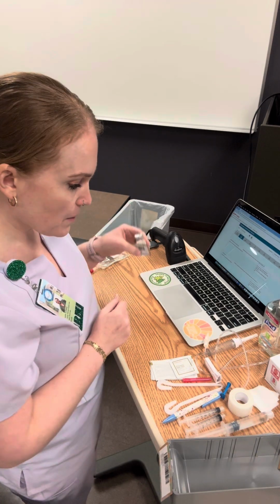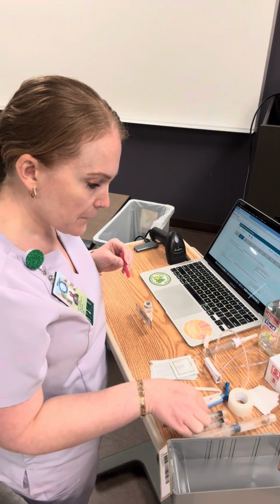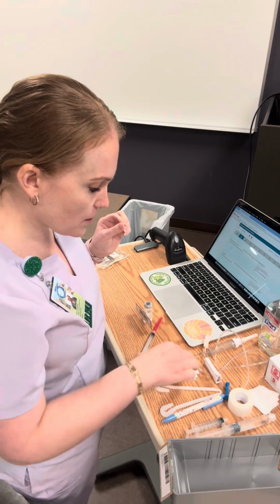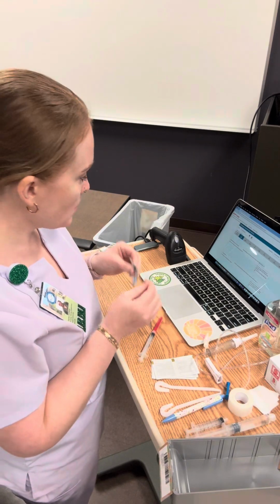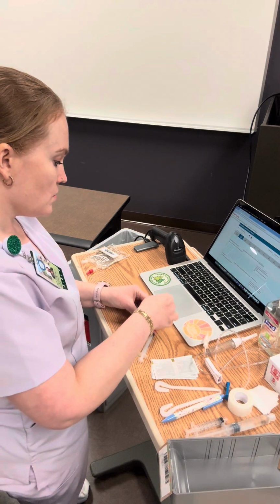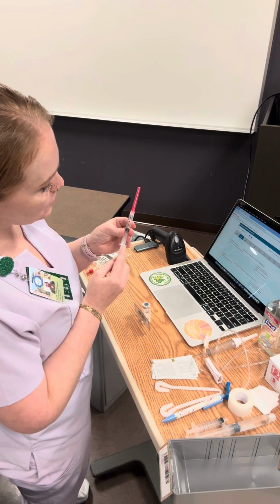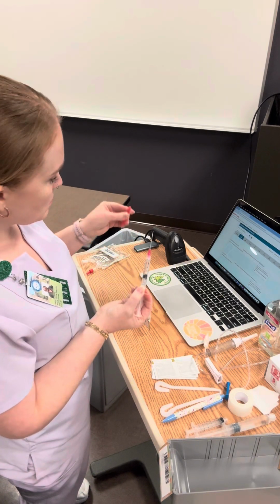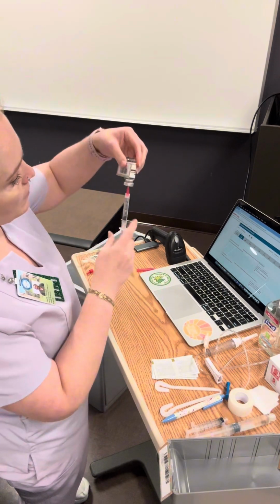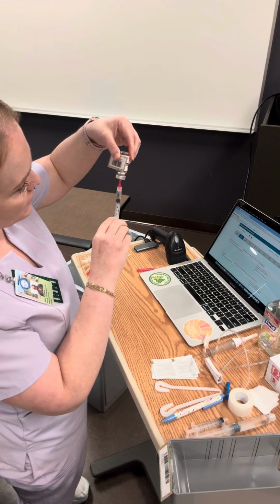So I'm going to prep my medication here. I'm going to grab a syringe with the needle attached. I'm going to clean off the top of my medication. This is clear. I'm going to pull back the 2 milliliters because that is what we've done. Insert this in, invert it, add the 2 milliliters, ensuring that we don't get any bubbles of air.